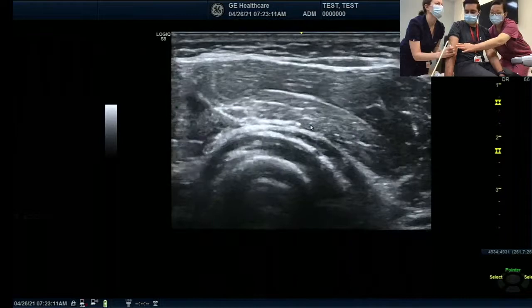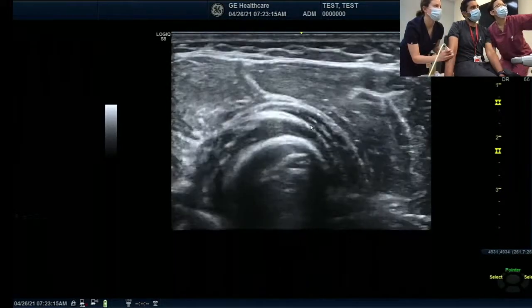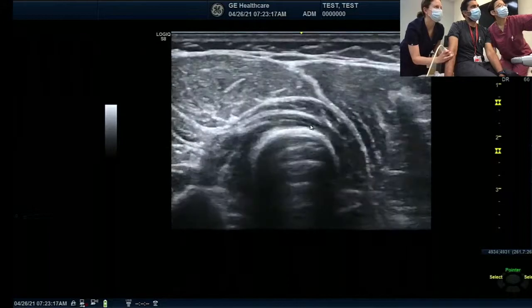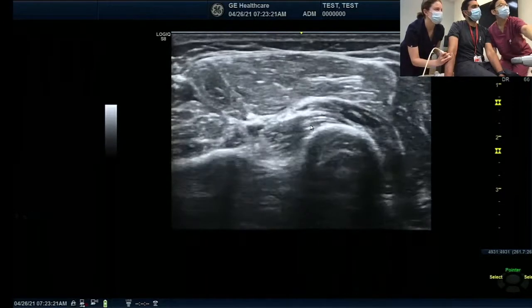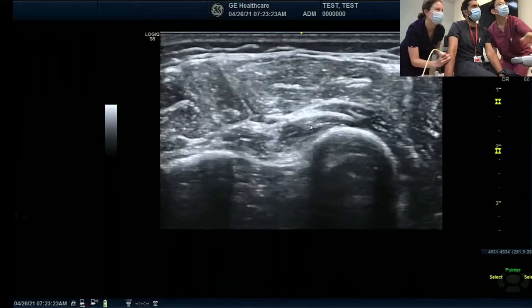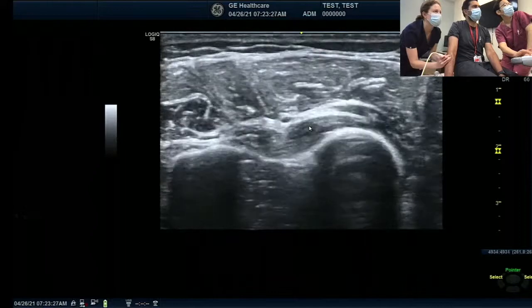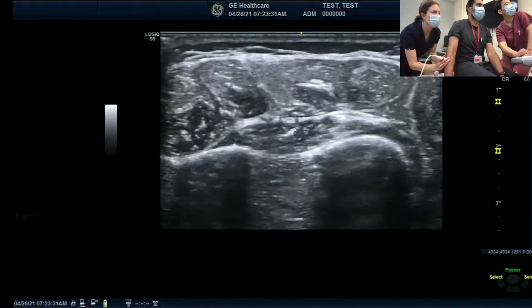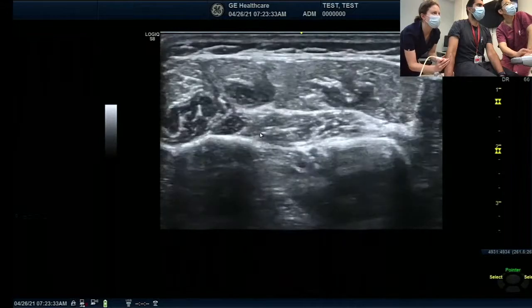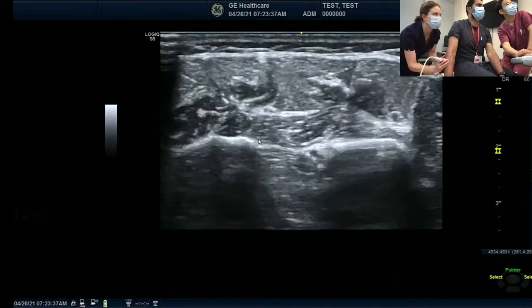You have to go radially and then distally. Oh, you're following the radial nerve. Okay, good job. Sorry, it was going away from me. Okay, now clear. Now you can go distally. So this is already a nerve, one, two. And now it's dying, so move a little fast.